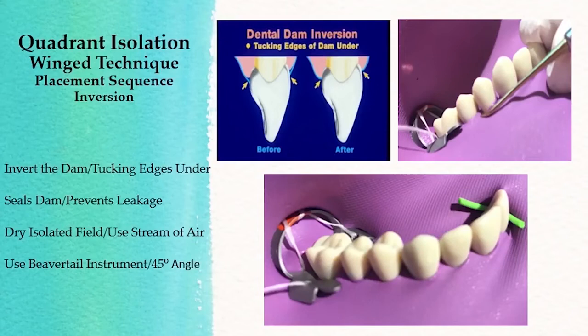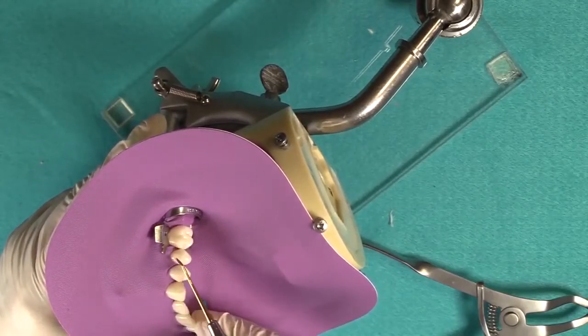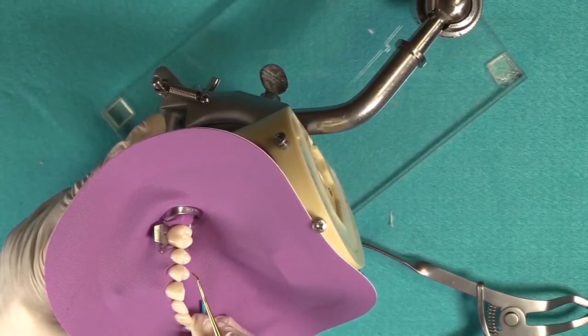But normally, if you have someone to help you, they would blow air at the gingival sulcus. Well, I guess what we do is we would suction everything dry, and then they would blow air with a triple syringe, and you would lay your instrument at a 45-degree angle and just tuck it under.